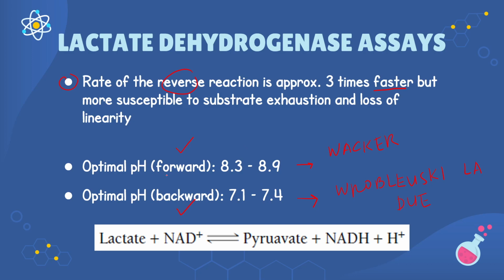So going back to your chemical reaction, again, this is representing your forward reaction starting from your lactate. If it is the reverse, then we will begin with your pyruvate. So just correct the spelling of your pyruvate here.